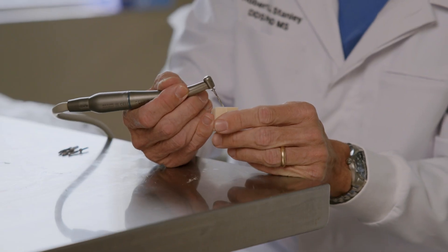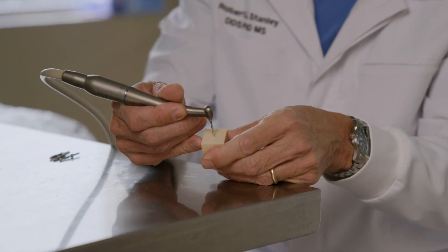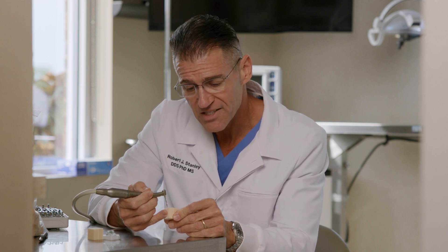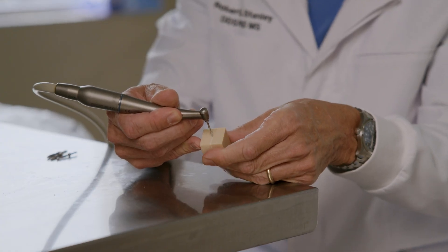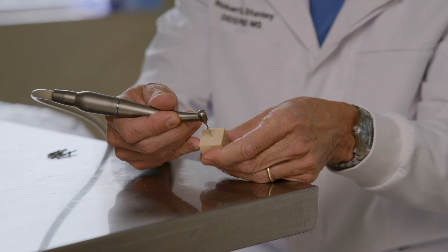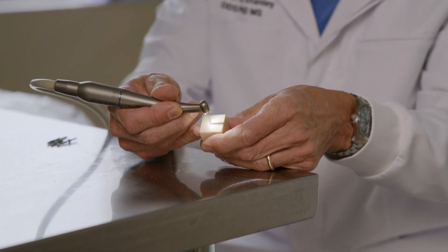I'm trying to visualize exactly where the center is on this cube, but I'm not quite sure if I'm in the center. I don't have a ruler or any way to measure, and this is a whole lot easier on a foam block than in a real mouth because the real mouth doesn't have sharp edges. So we're going to guess at where the center is and go ahead and start the drill. As soon as the drill hit the dense foam, it knocked right off into the soft foam.